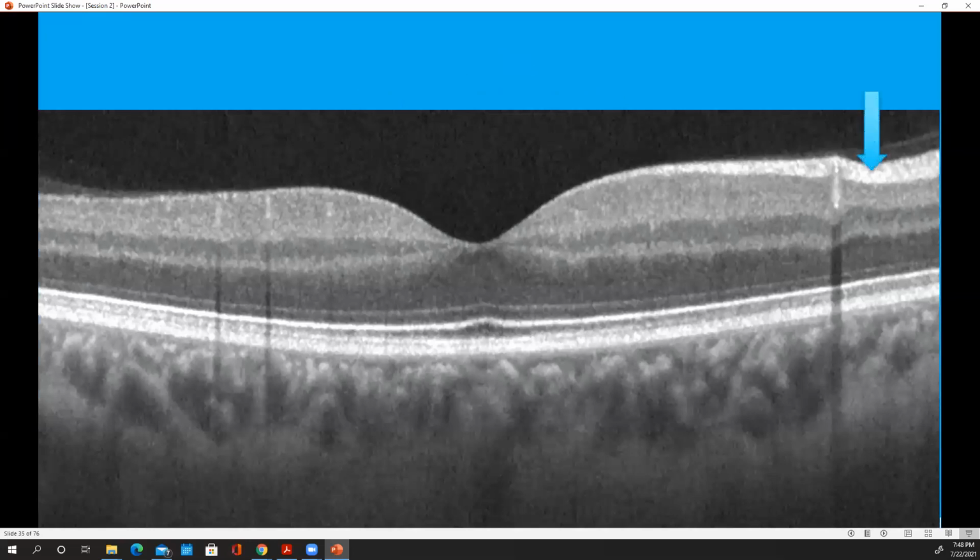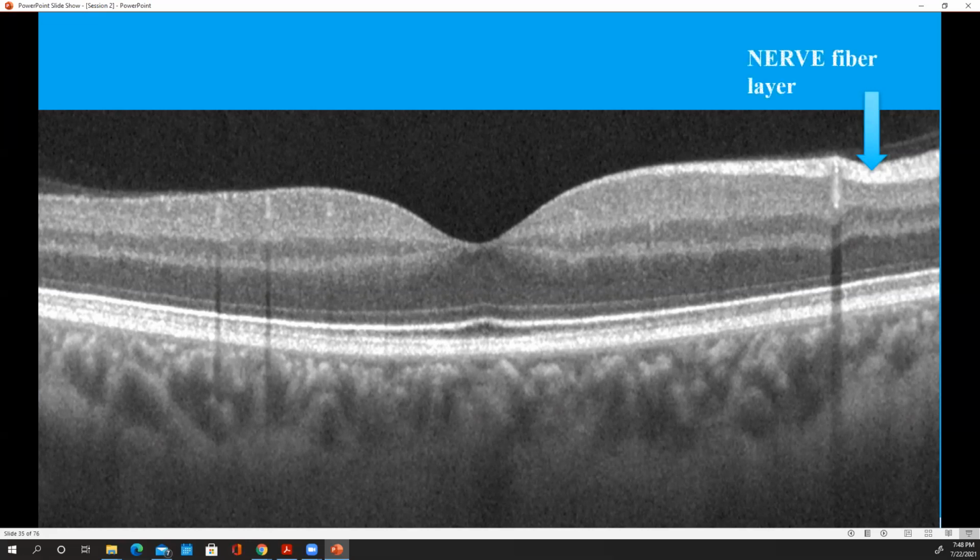So if I point to this guy, this is light. Do you know what this layer is? The nerve fiber layer? Yeah, nerve fiber layer. Nerve fiber is just another word for axons together or plexiform, but in another way. We just like to mess with people nomenclature-wise, so we feel special. So you have this nerve fiber layer, which is still an axonal layer. There's no difference.